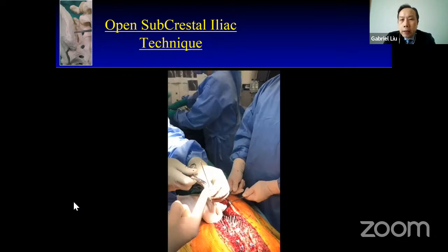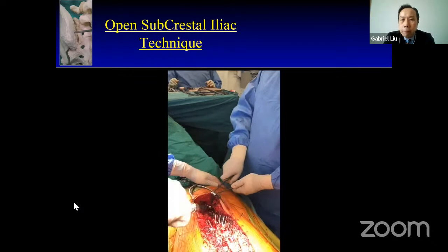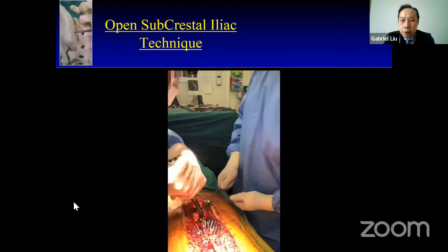The other thing that we identified is that we tend to flush away the bone marrow from the hole, because we have actually had fat emboli before from insertion of this screw. It's like a long bone femur fracture fixation, and as a result it causes problems.